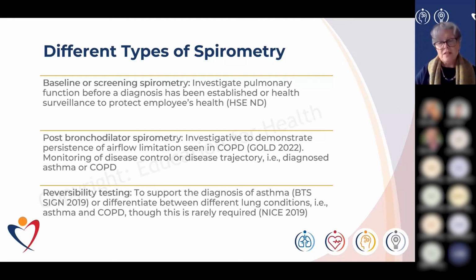So let's look at the different types of spirometry then, because there are different types that we will use in primary care. We can use the baseline spirometry or screening spirometry. So that investigates pulmonary function before a diagnosis has been established, or as part of health surveillance to protect employees' health, as put forward by the HSE.